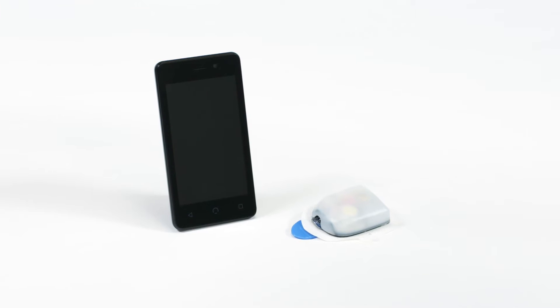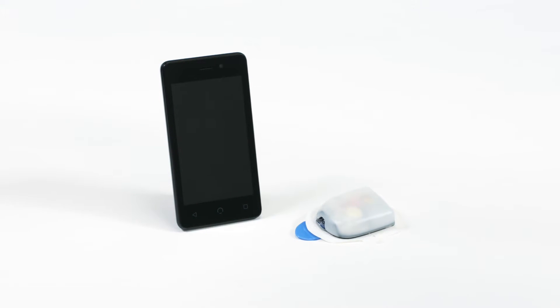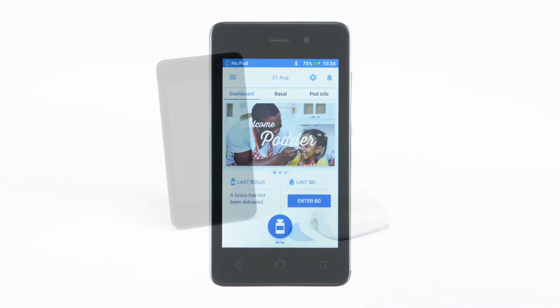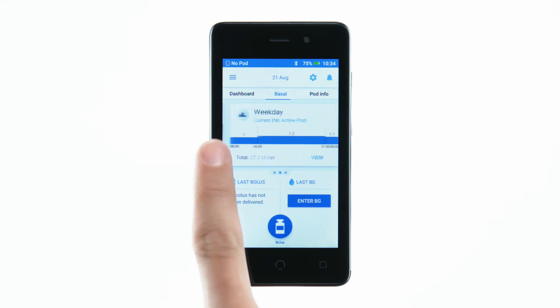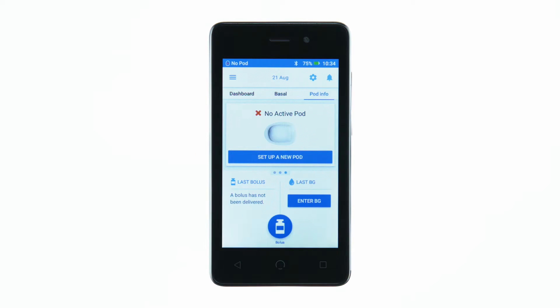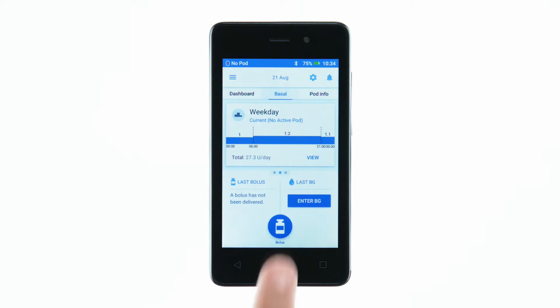The PDM controls all the pod's functions and has a touchscreen similar to a smartphone. The home screen has three main views: Dashboard, Basal, and Pod Info. There are two main actions you'll perform when navigating the Omnipod PDM: tapping and swiping.